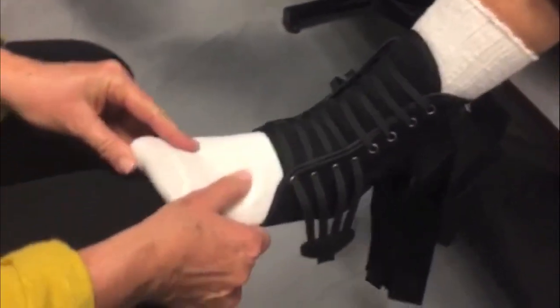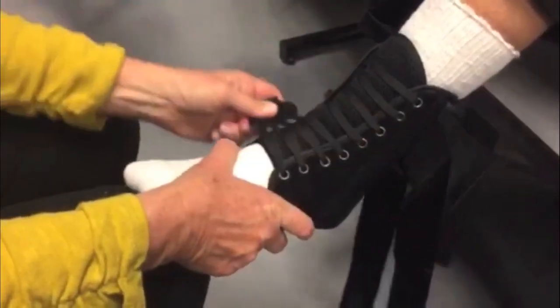Open the brace and slide the foot in, making sure to seat the heel in the rear opening of the brace. Pull and fasten the lower strap.